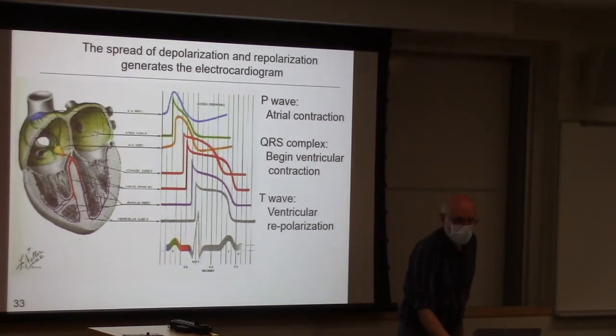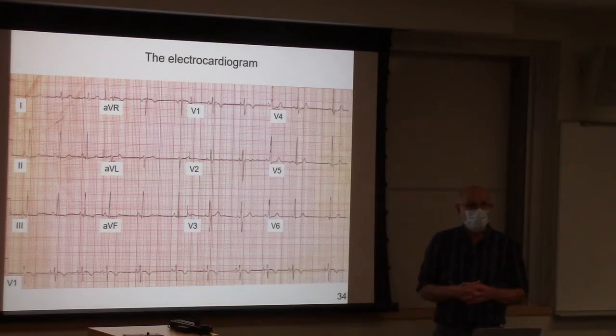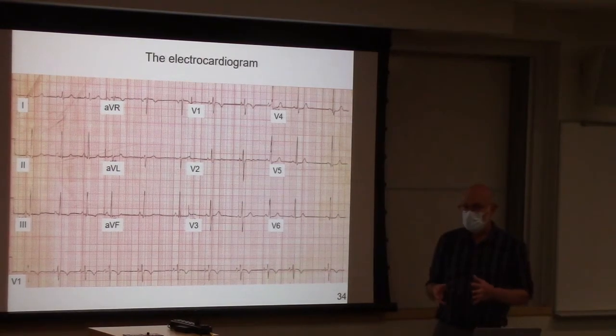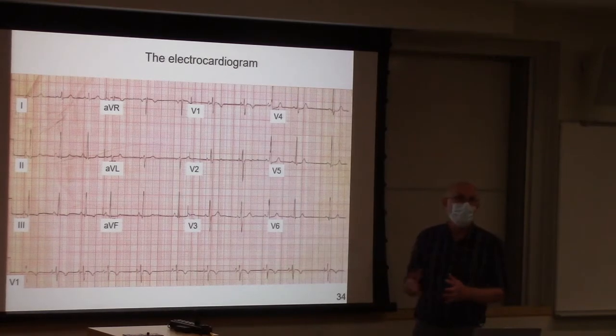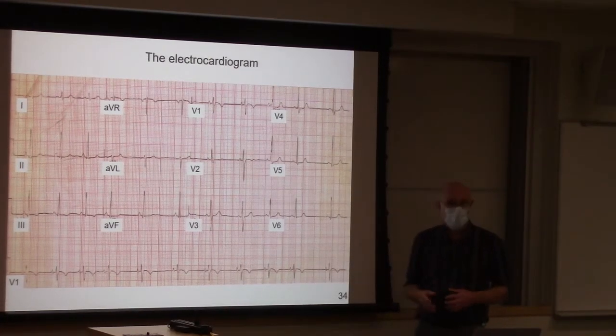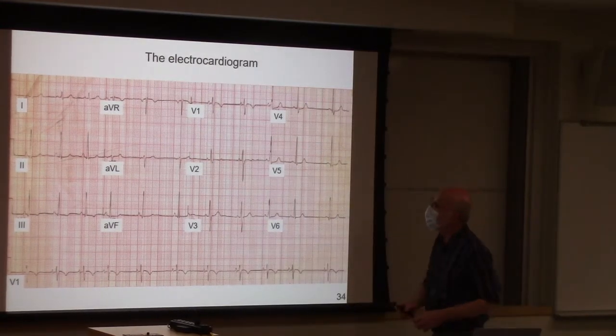Now let's break it down. Here is an electrocardiogram that might be recorded in the hospital. You are going to work with this exact signal recording on the problem set. But here's what you should see.